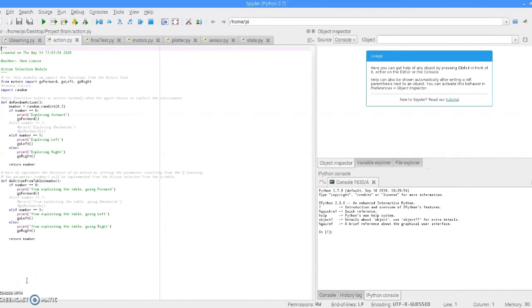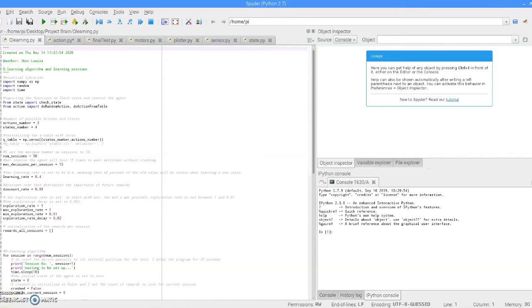Inside the action file, we see 2 functions for when the agent chooses to do a random action or when it chooses to do an action from the Q-table. The Q-learning file is where the Q-learning algorithm is implemented. In here, we import all the other functions that we previously made.